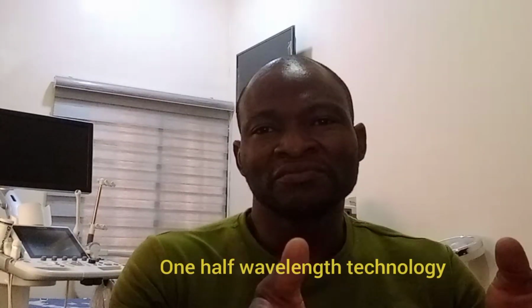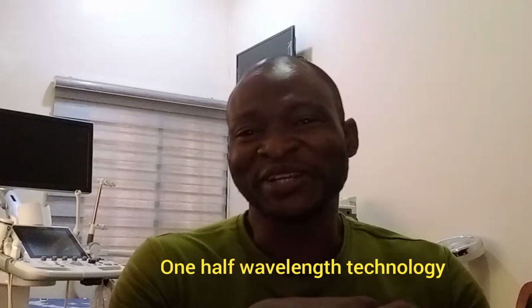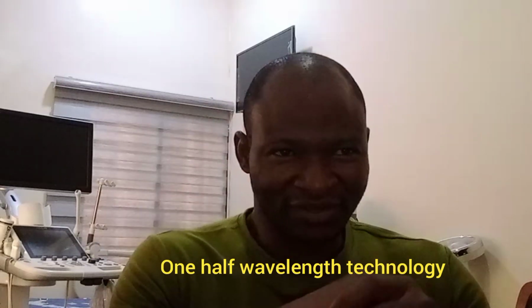Now, there is such a thing as half wavelength technology, or 1/2 wavelength technology. The thickness of the crystal is half the wavelength of sound traveling in the crystal. It means that to make a specific resonance frequency, the crystal needs to be cut to a thickness equal to 1/2 of the wavelength of that frequency, based on the speed of sound in the crystal material.